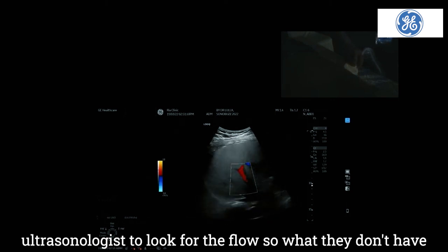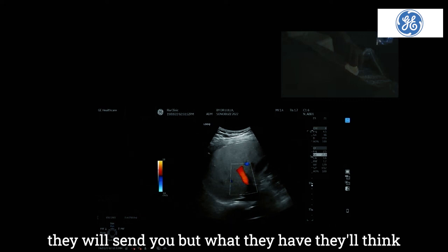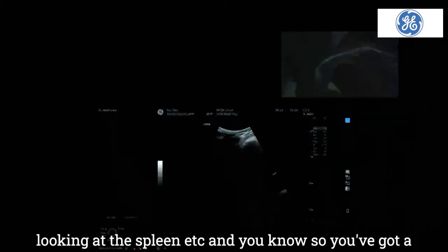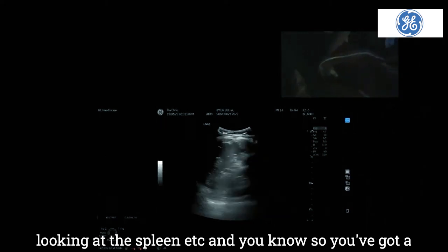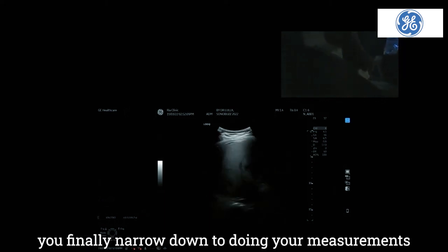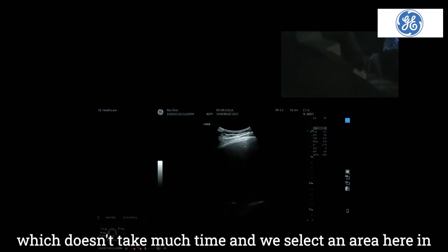So what they don't have, they will send you, but what they have, they'll think twice and say Fibroscan is better. So immediately you're looking at the spleen, etc. And you know, so you've got a lot of information. Is there ascites? Is the surface smooth? And then you finally narrow down to doing your measurements, which doesn't take much time.